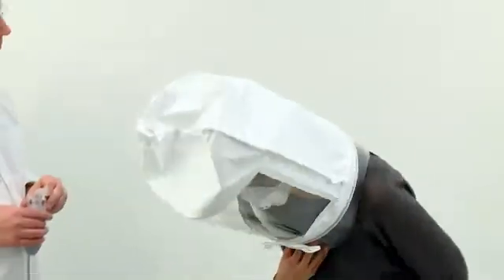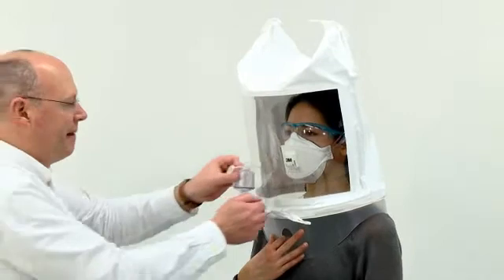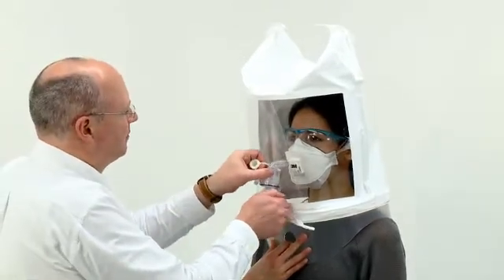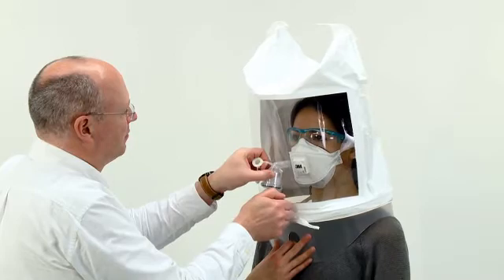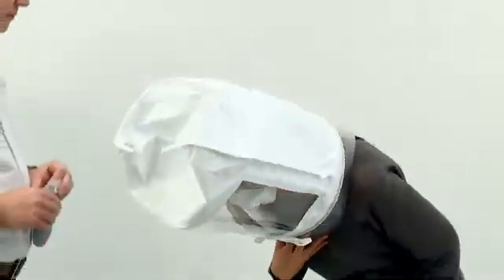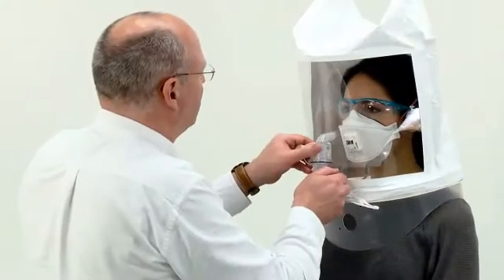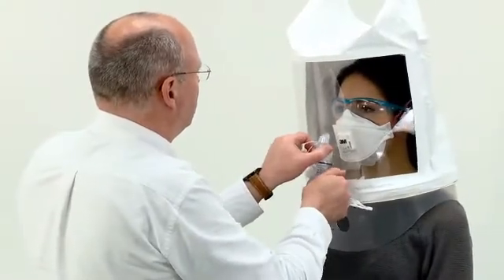After one minute of this exercise, ask the subject to bend at the waist as if to touch their toes. Remember to top up the concentration every 30 seconds. Finally, ask the subject to carry out a minute of normal breathing. Remember to top up the concentration every 30 seconds.